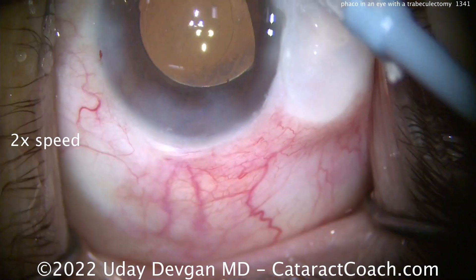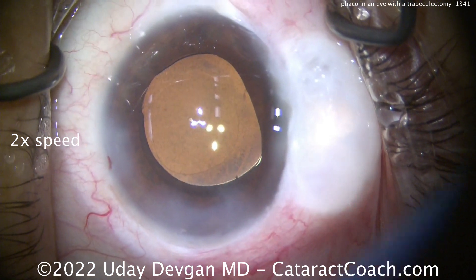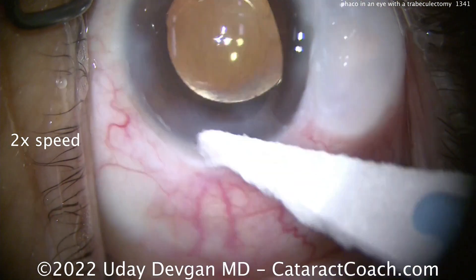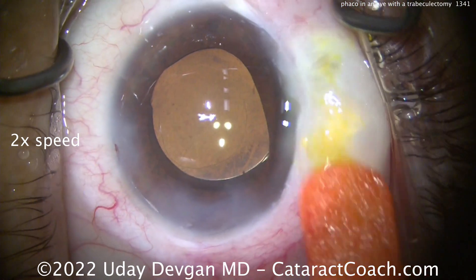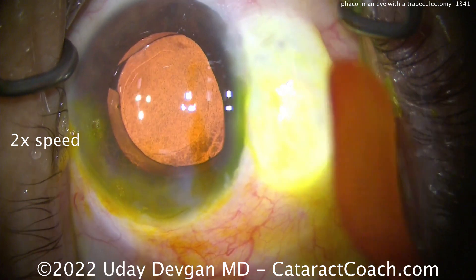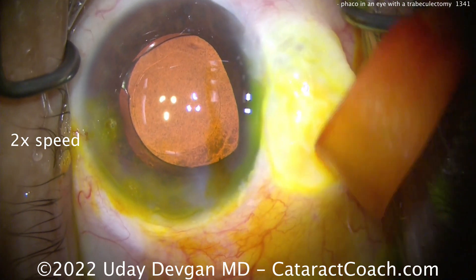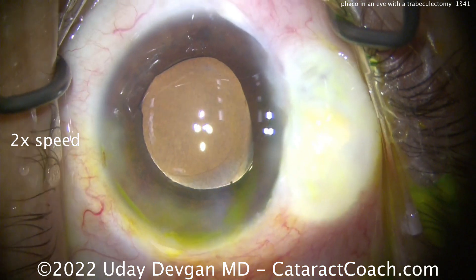And then one step further — here's a small astigmatic treatment. But one more step: we're going to use the fluorescein dye to do a Seidel test, a dye leakage test. Paint everything — the incisions and the bleb — with that fluorescein dye. Then we can see: do we have any leakage? And we don't.